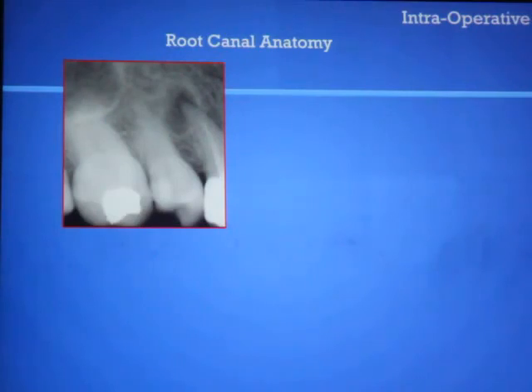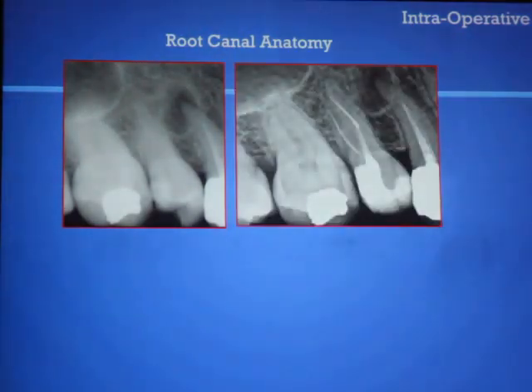Let's see the intraoperative use of conebeam CT machine. In this case, I had seen this before I had a conebeam CT machine in my rooms, and this tooth was a problem. The referring dentist found out this tooth was giving pain to the patient, and the dentist started the root canal treatment. And this is what I got when I saw the patient, that there were 2 broken instruments in the tooth, and the dentist could not continue the root canal treatment.